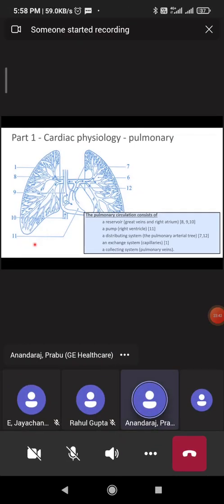And that too, if they are already connected to a central line, most likely they would also be connected to a monitor with a cardiac output feature. So there they can do a thermodilution method, better than trying to do it on the R860 just for the sake of it.